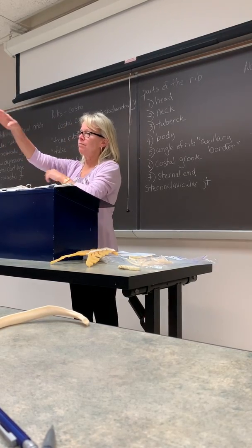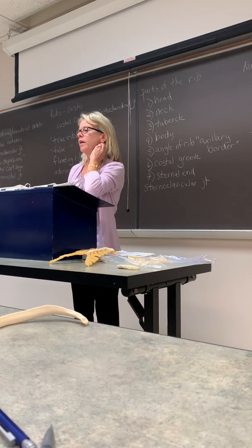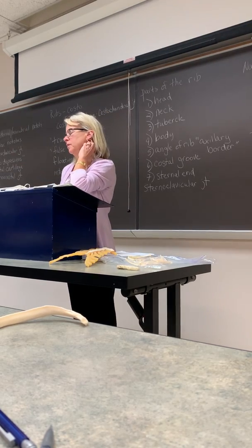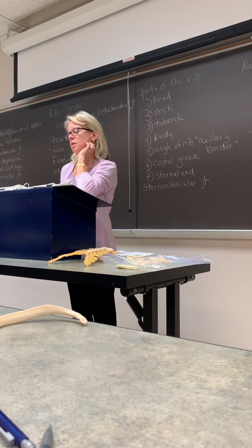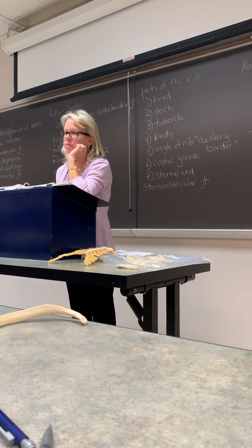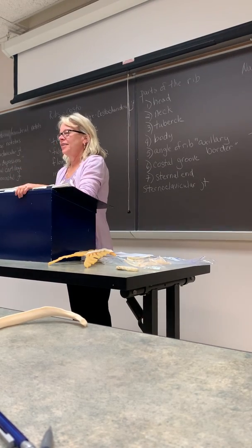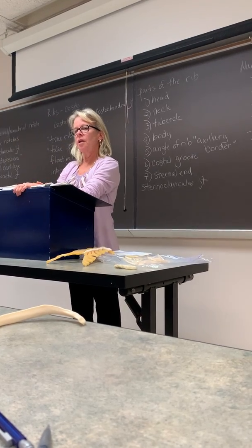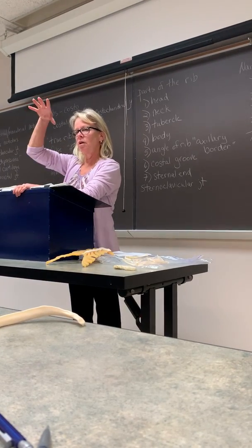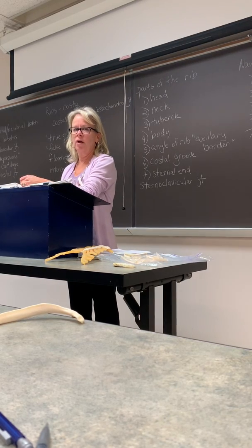Because when you take in a deep breath, the diaphragm moves down, so you want it to move out of the way of the upper ribs. Deep inspiration. Don't tell me I said expiration. So upper ribs, deep inspiration to move the diaphragm down. Lower ribs, expiration to allow the diaphragm to move up, so you see more lower.